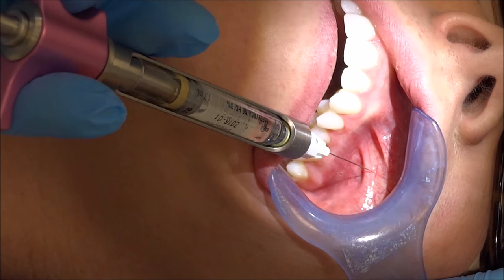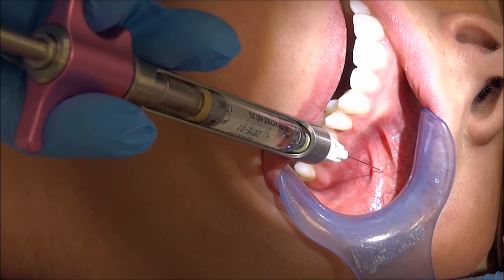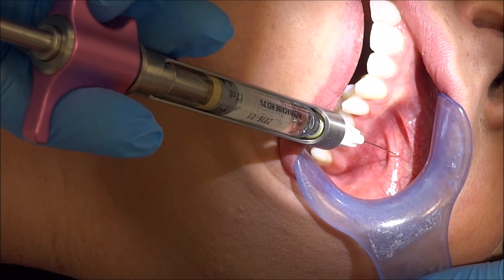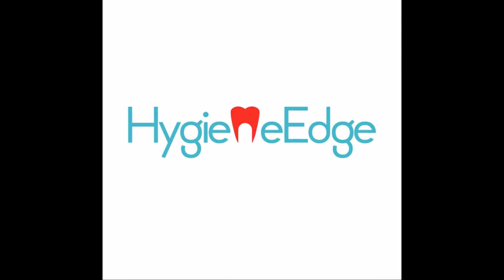If the frenum is in the way, you can choose either side to insert. Insert about four to five millimeters, aspirate, and deposit about one-fourth of the carpule to prepare for periodontal debridement procedures.